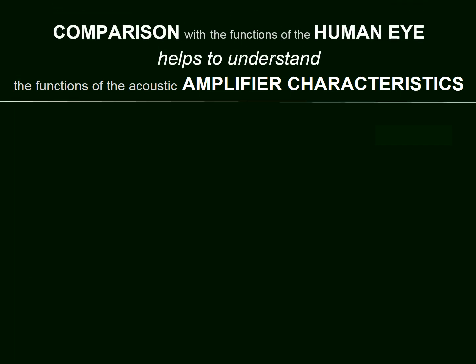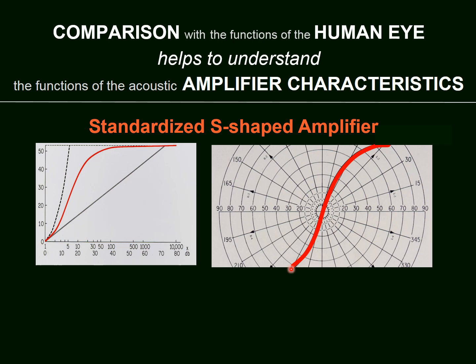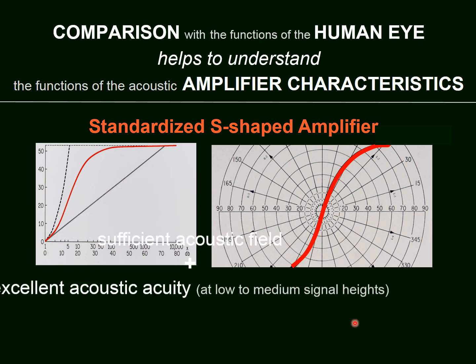Compared now with the functions of the human eye, we see here the results. A good, sufficient acoustic field combined with an excellent acoustic acuity.